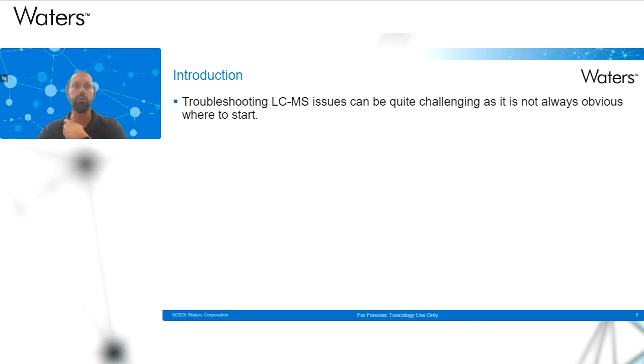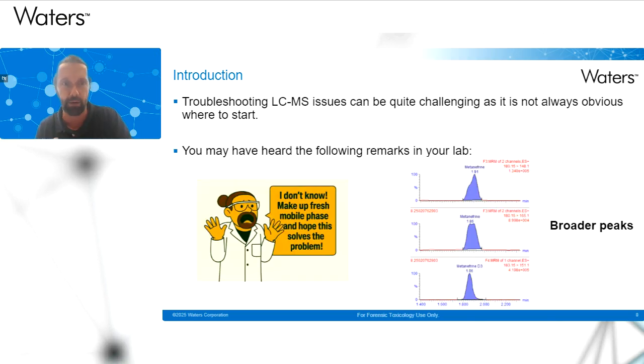Now, let's take a look at some issues that you could be facing in your lab. And I've got Martin helping me out very nicely. So we are seeing this chromatogram over here, and the peaks have broadened up quite a bit. And Martin is saying, well, I don't know what's happening. Just make up some new mobile phase, and hopefully this will solve the problem. We will dive into specifically this issue later on.